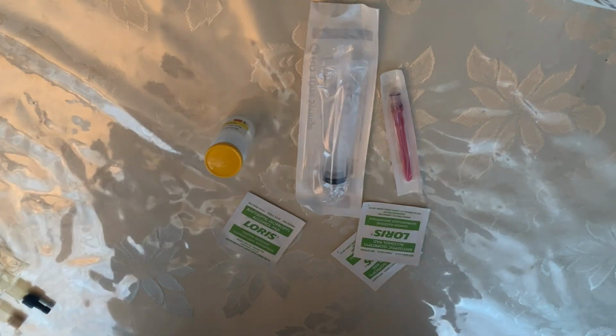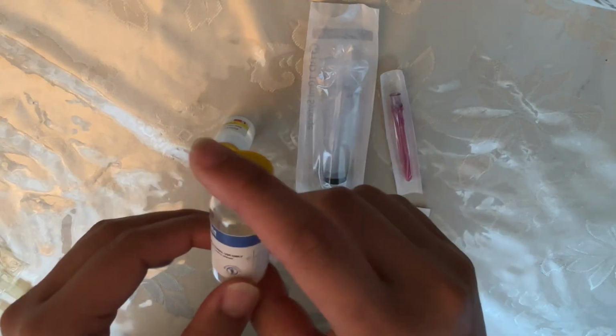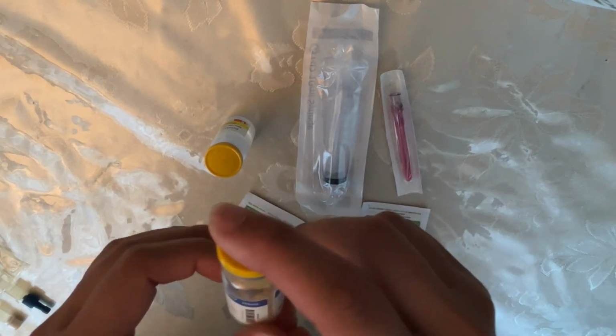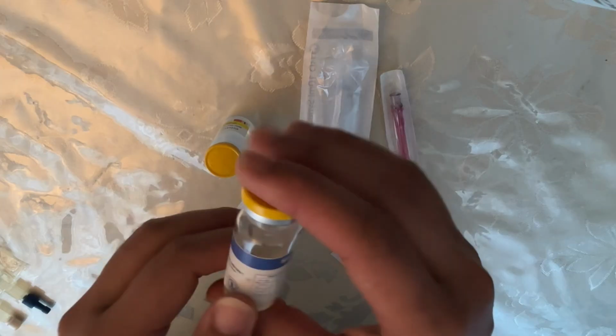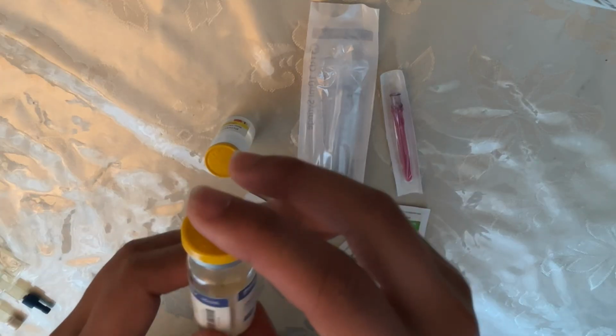I'll compare the medication against the MAR, making sure that it's not expired and I have the right dose. My order is 0.5 gram and to be administered IV. And for me to have my ordered dose, I need to reconstitute the medication.